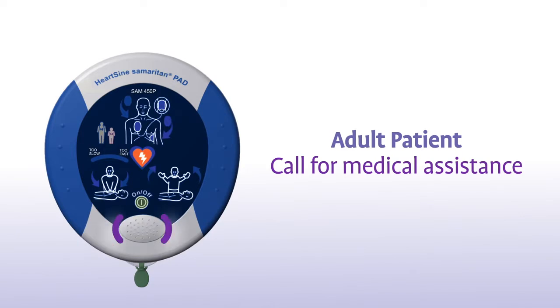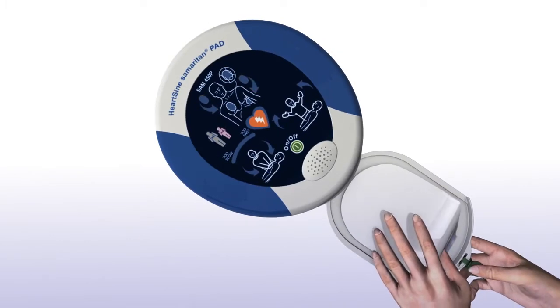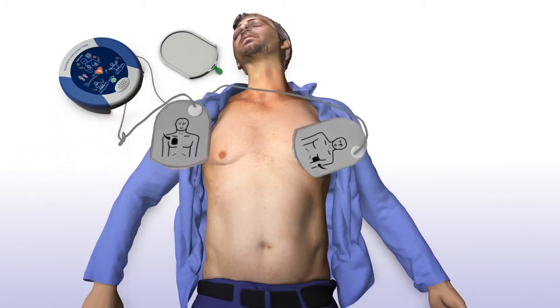Adult patient. Call for medical assistance. Remove clothing from patient's chest to expose bare skin. Pull green tab to remove pads. Peel pads from liner. Apply pads to patient's bare chest as shown in picture.